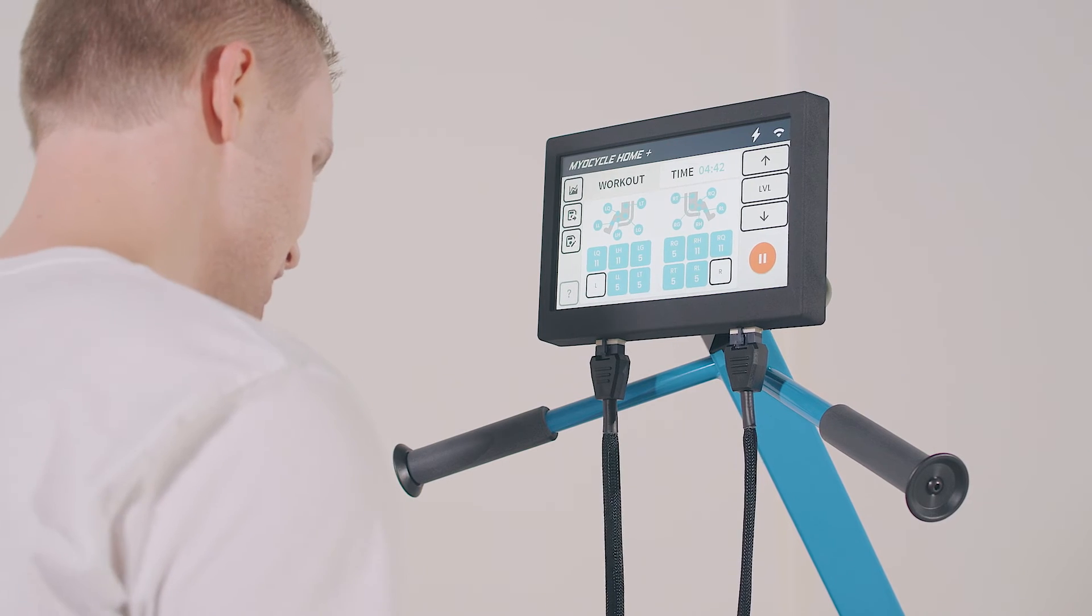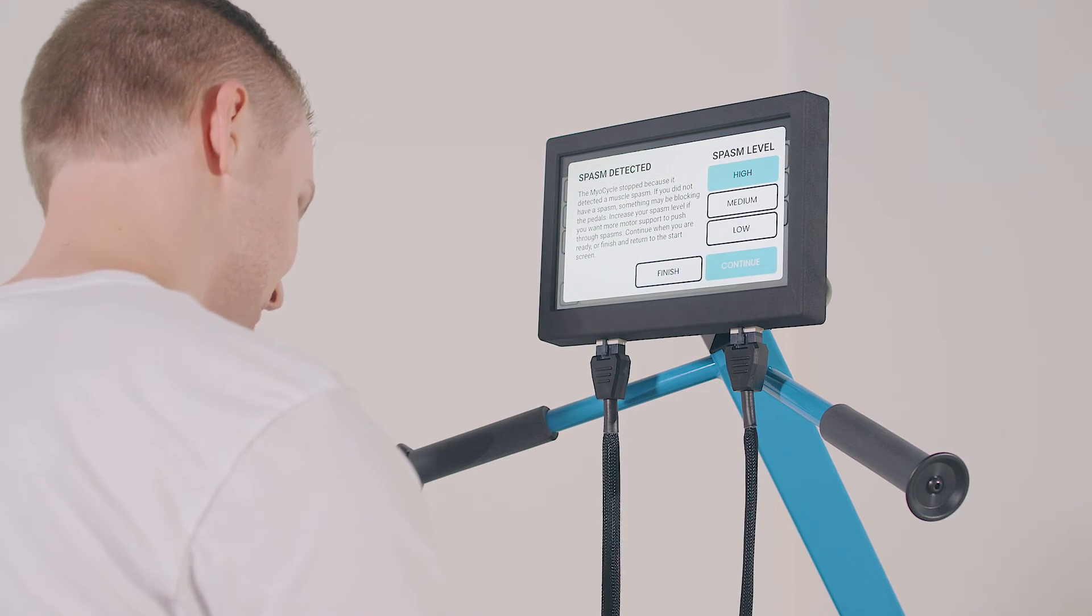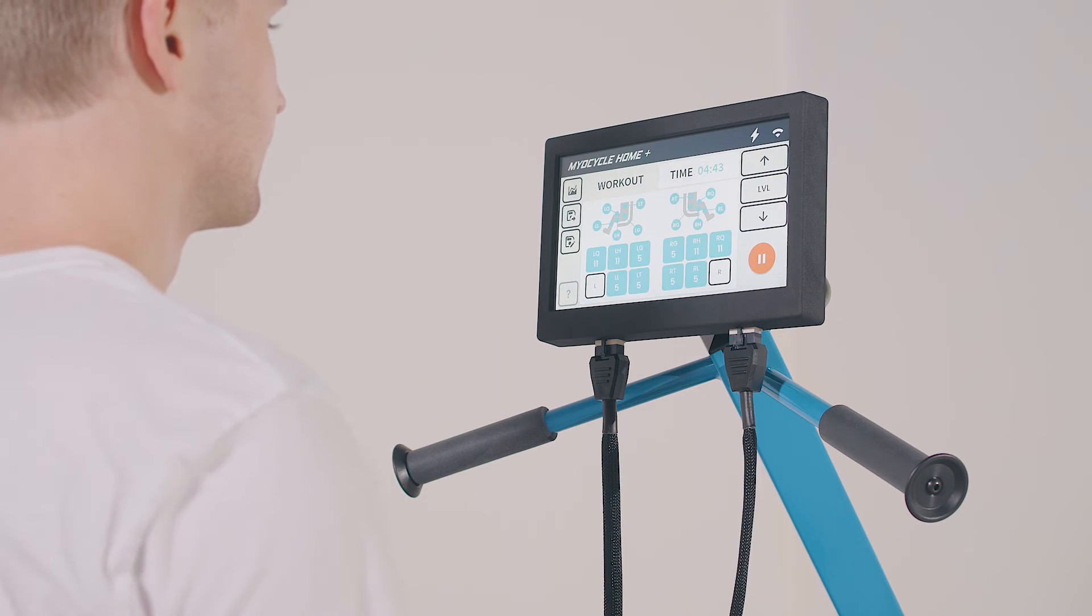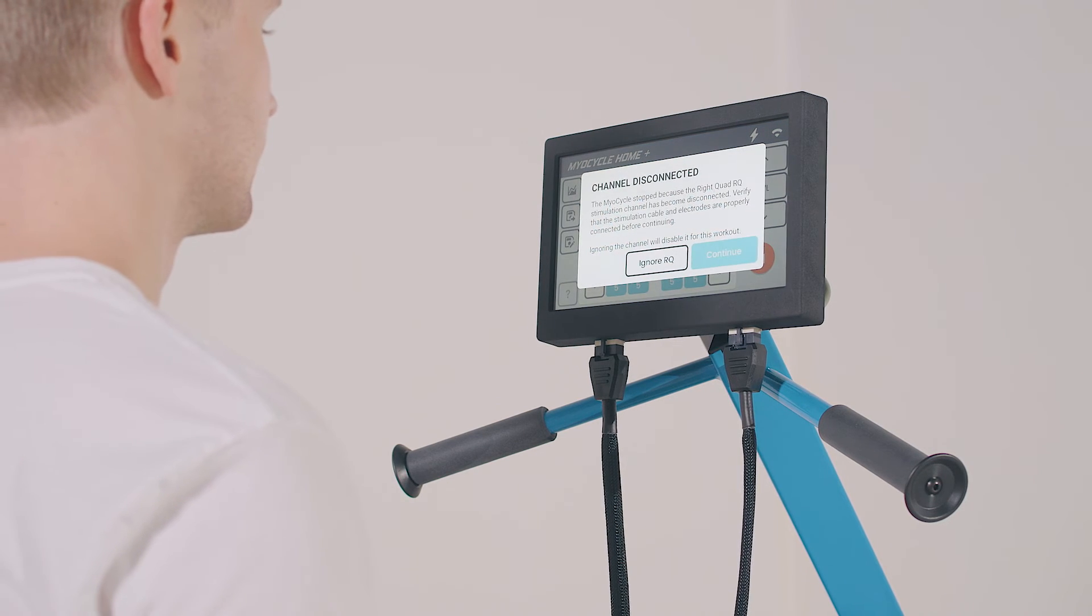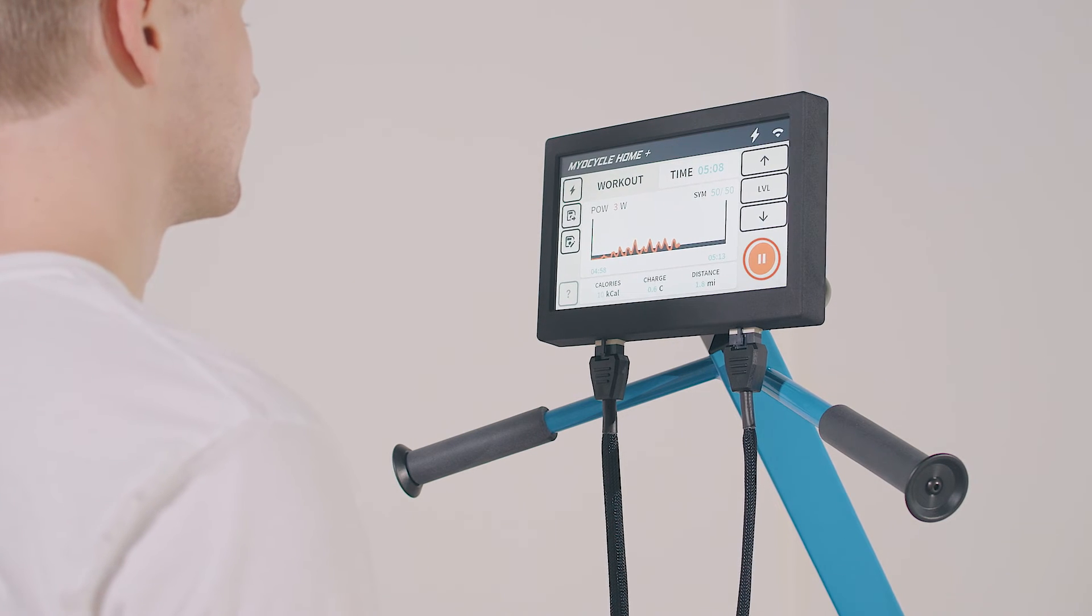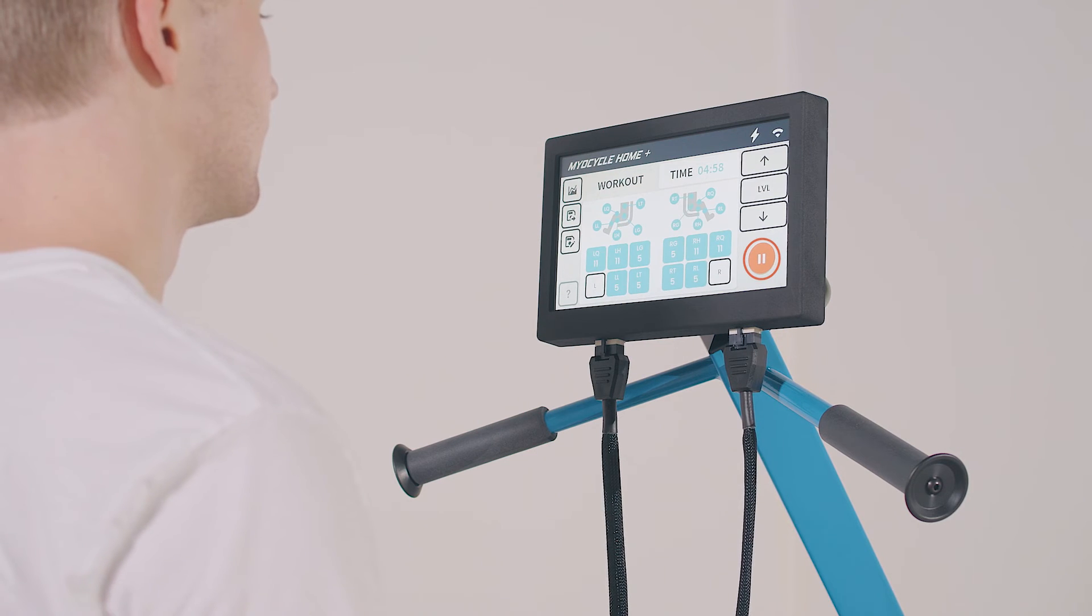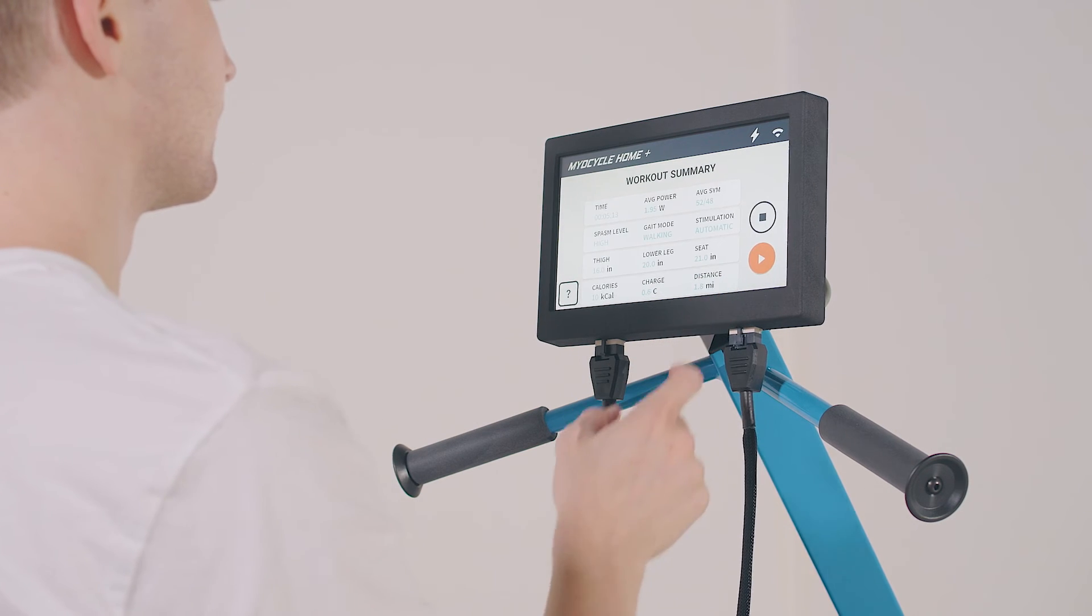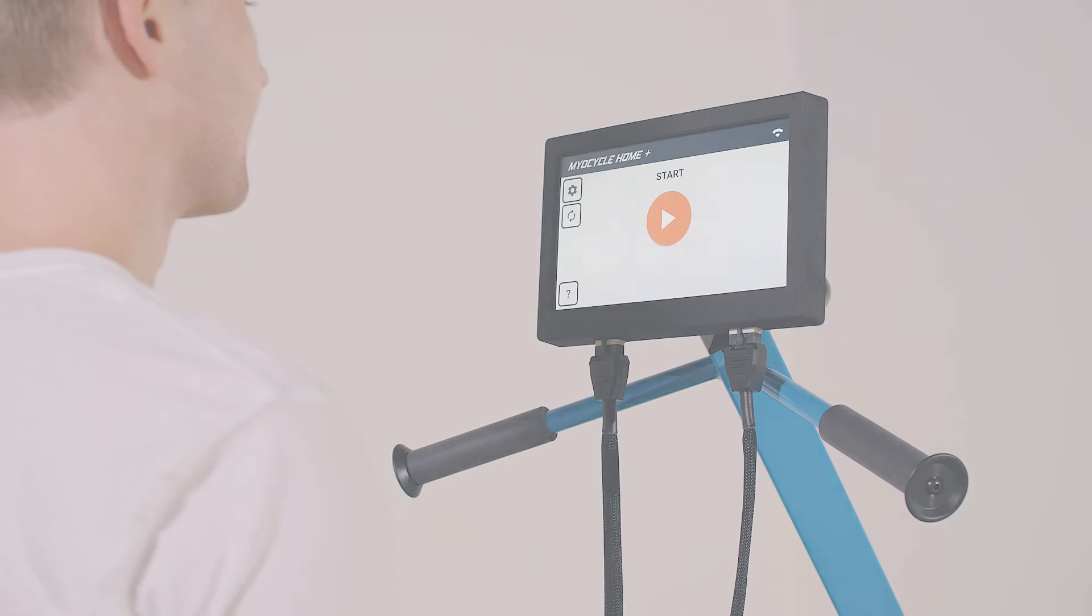If you have a muscle spasm during your workout, the myocycle will detect the spasm and pause the workout. When you're ready, you can continue your session. Similarly, if any of your electrodes disconnect from the stimulation cable, the myocycle will pause and notify you. The pause button in the lower right corner on both the power display screen and the channel select screen can be used to pause or end the session. The myocycle will pause and display a session summary. Simply press finish to end your session.